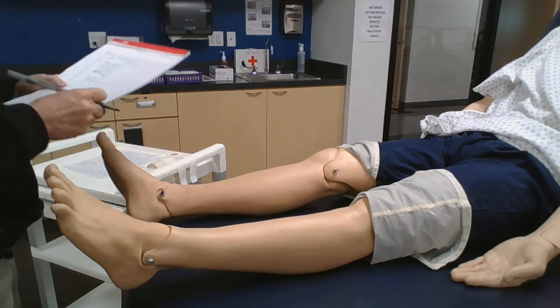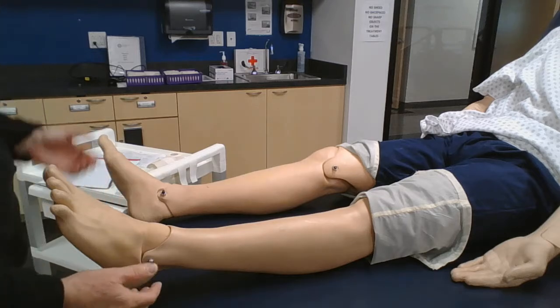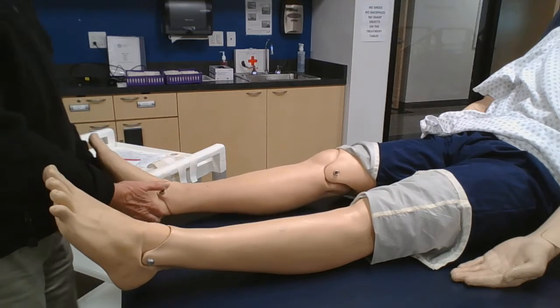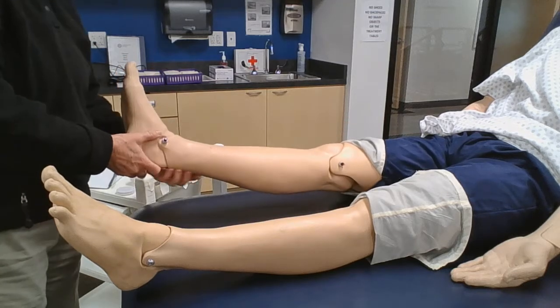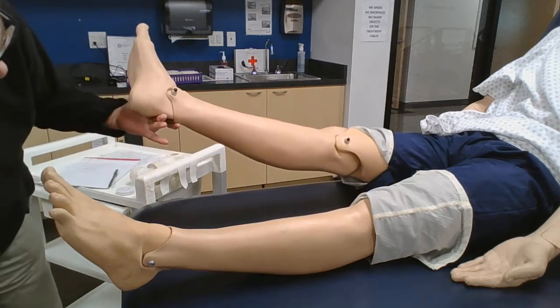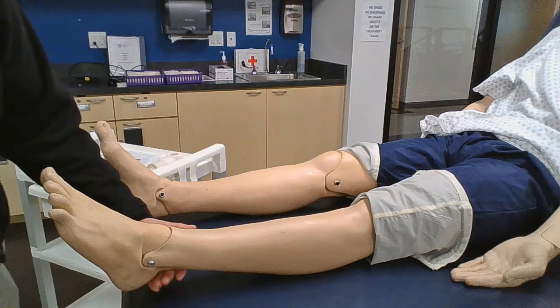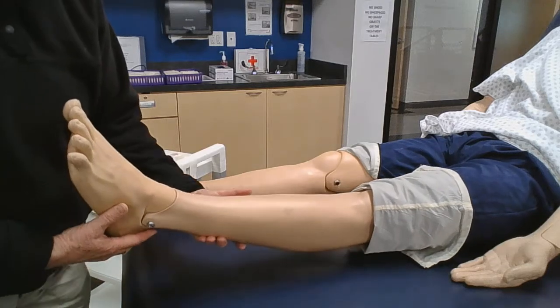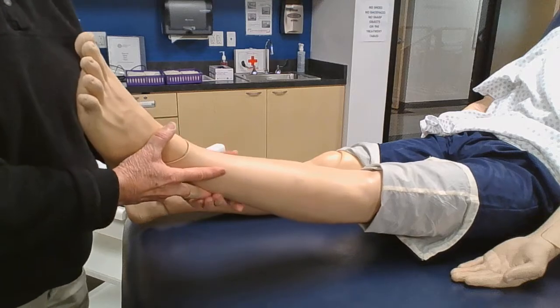Okay, so first I'm going to observe. Okay, I want to be looking. What am I looking for? I'm looking for, does he have any abrasions, any cuts or scrapes anywhere? Okay, I want to be looking, any blisters already, looking at the uninvolved side first, and then I'll go gently. Okay, this guy's got a sore ankle. It might be all puffed up, you guys know.